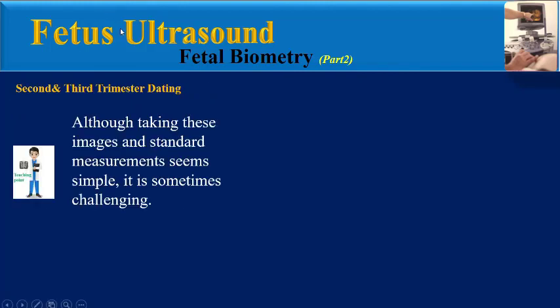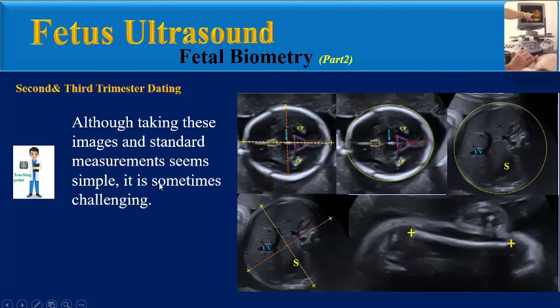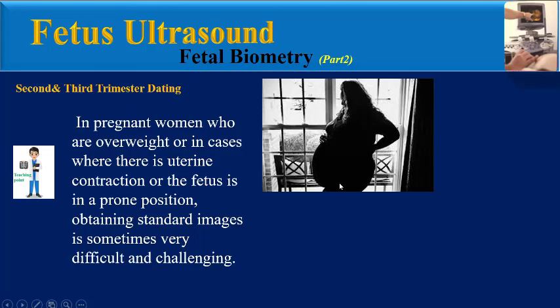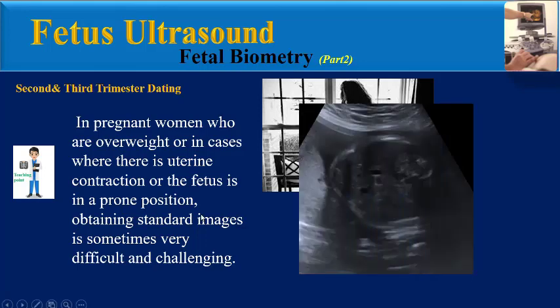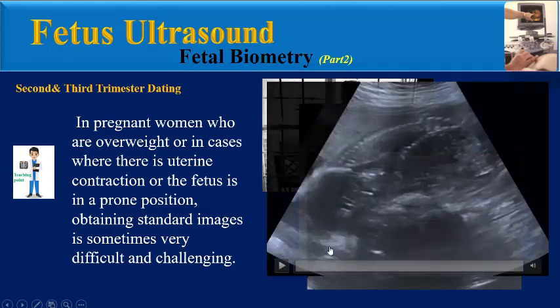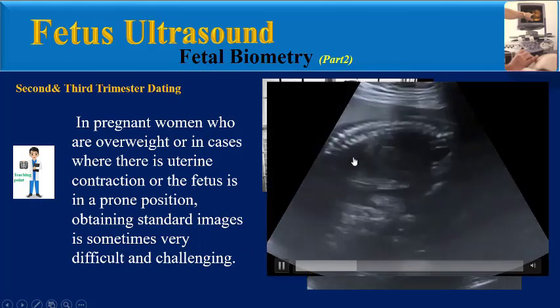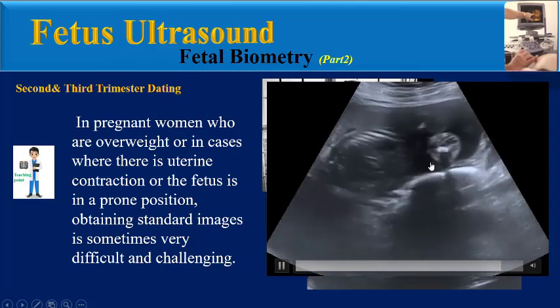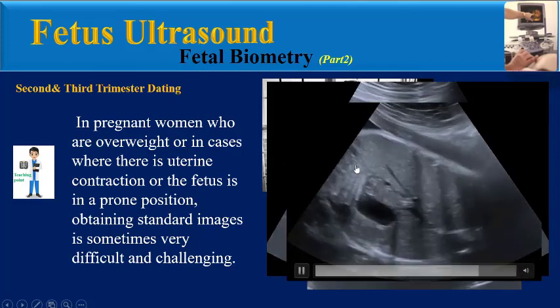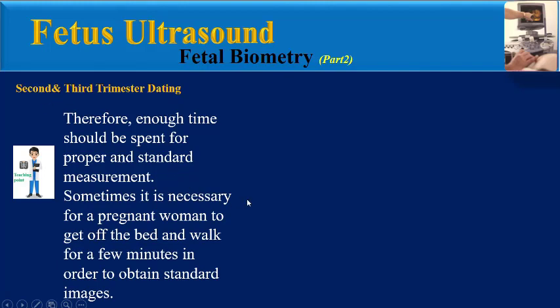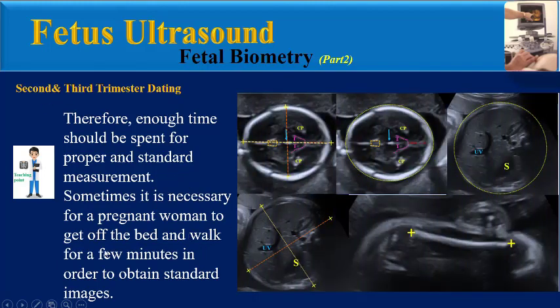Although taking these images and standard measurements seems simple, it is sometimes challenging in pregnant women who are overweight, or in cases of uterine contraction or a fetus in a prone position. As seen in the clips, obtaining a standard abdominal circumference view in a prone fetus or in a twin pregnancy can be very difficult. Therefore, enough time should be spent for proper measurements, and it is sometimes necessary for the pregnant woman to get off the bed and walk for a few minutes to obtain standard images.